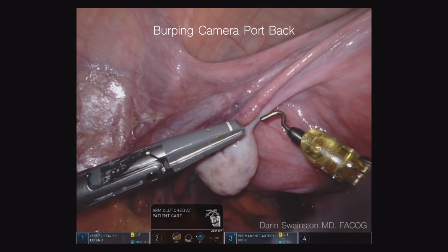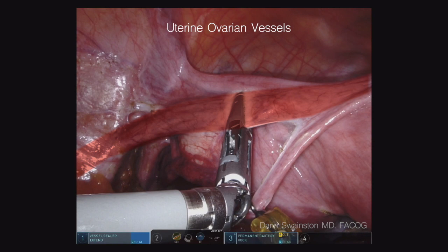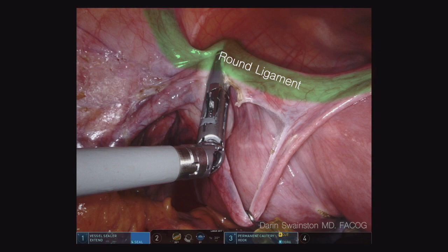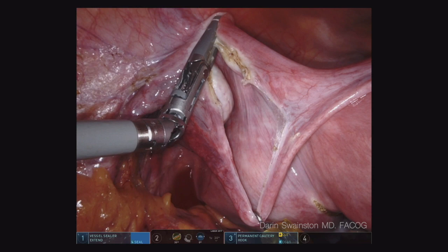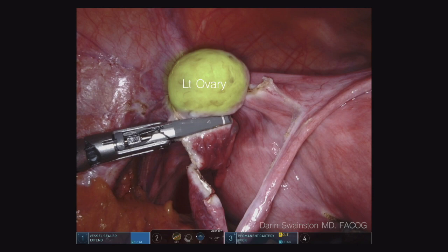We'll see that perpendicular grasp on the uterine ovarian vessel. In this case, we incorporated some of the uterine ovarian ligament. Then we continue out lateral. You can see that round ligament — there will be one more purchase on that to go right up underneath. See that downward traction with the right hand, upward traction with the left — it creates a wonderful space. Then I can finish the salpingectomy last. It allows me to have really good visualization. I don't really need an assistant when I'm doing this technique. In under five minutes, this part of the whole procedure is done.